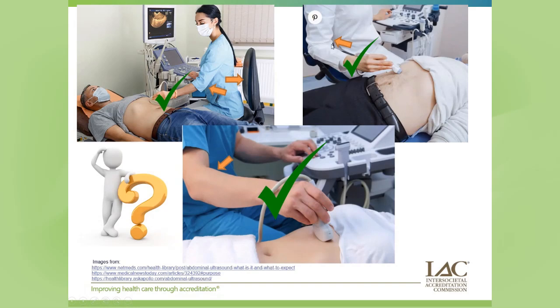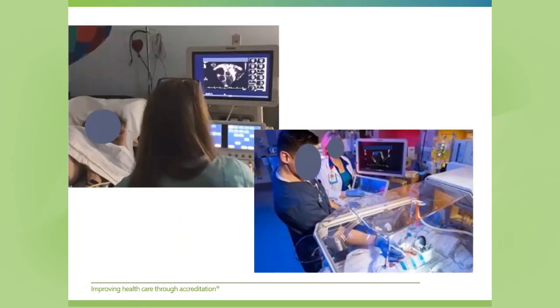With this one on the top right, thinking about keeping that upper arm at more of a neutral position, thinking about it being in line with your torso, you can see that this one appears to be pushed back a little bit. And so can we position our chair more appropriately so that we aren't having to bring that elbow back farther? And then as you can see, with this person, they've got their arm out to the side a little bit more. So can we move our body closer to the patient so that we're getting underneath that 30-degree range for our shoulder and our elbow?